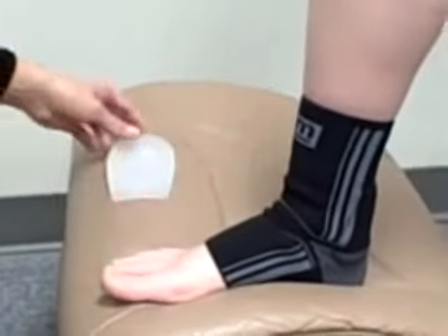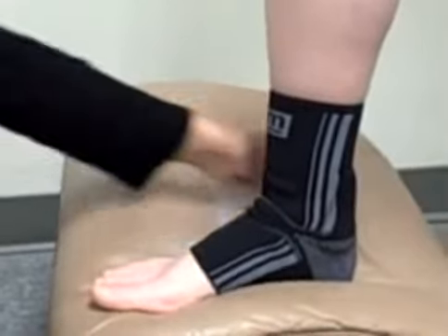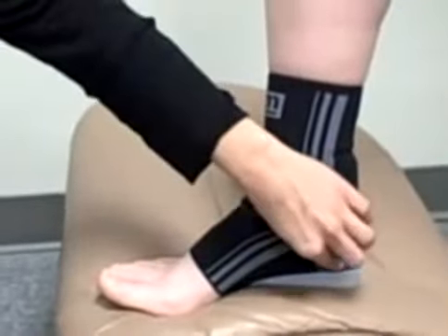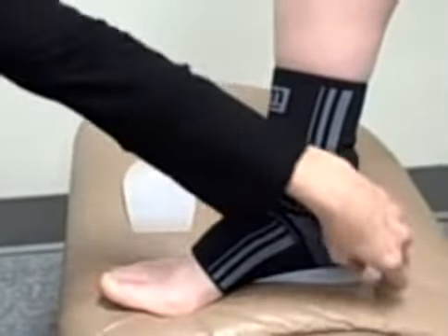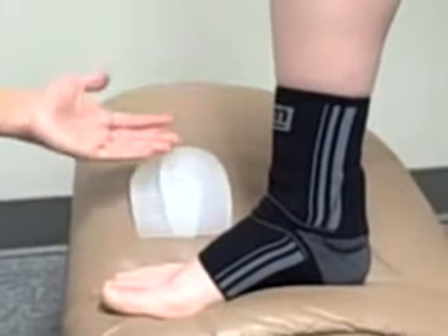The Acumed comes with a silicone insert to boost the foot up and take any pressure off the Achilles. You would wear that inside of the Acumed support. It also comes with a second silicone insert for the foot that is not injured in order to avoid any leg height discrepancies.